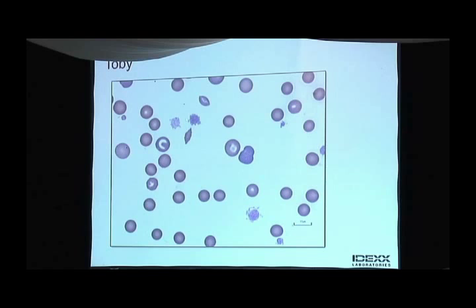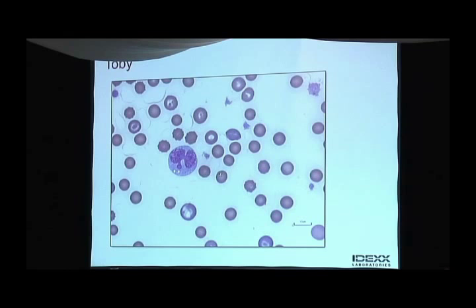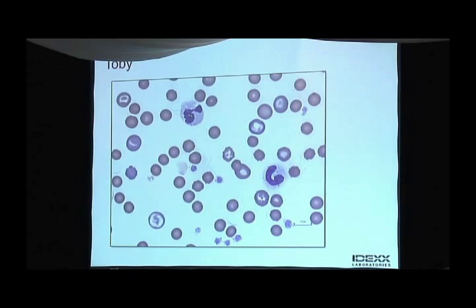All right, so, polychromasia, there's a red cell fragment, some giant platelets. So this guy, I'm not gonna show you all the values of the leukogram and thrombogram, but he has 165,000 platelets, and he has big platelets, which probably means that he has increased platelet turnover, so he may be destroying some of the platelets. Here's the monocyte, and again, you will see some nice spherocytes with polychromasia.